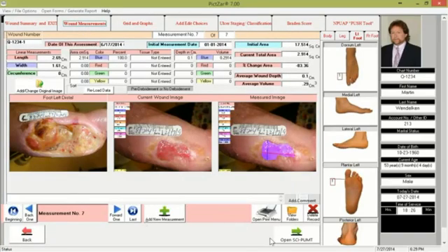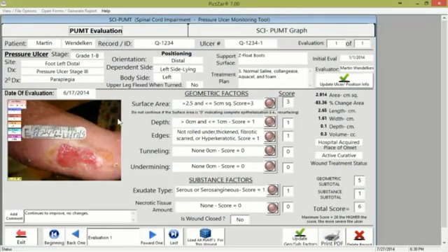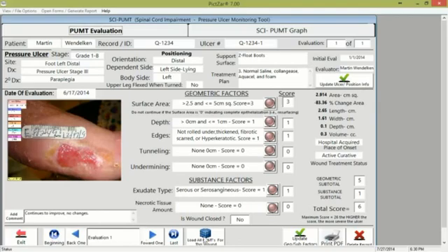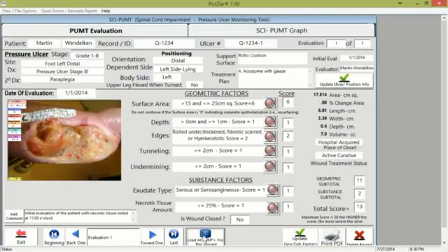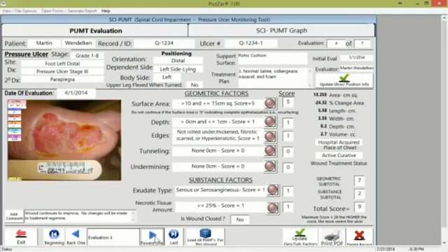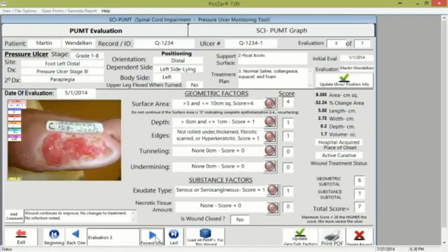The next area is the SCI-PUMT area — there's a button at the bottom right, and clicking it opens the PUMT area. The PUMT tool area consists of two main tabs at the top: the evaluation and the PUMT graph. All the data here is generated by the program and moved into the PUMT tool automatically. In the example shown there are seven evaluations, equivalent to the seven visits the patient had, and here I'm scrolling through the different PUMT scores.